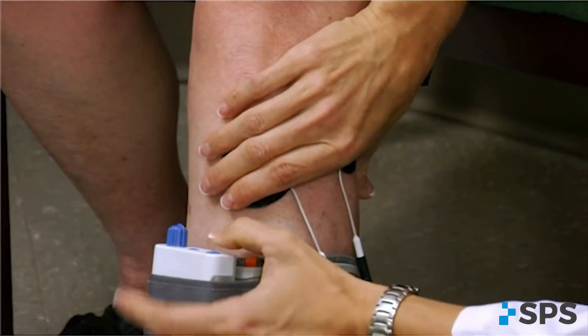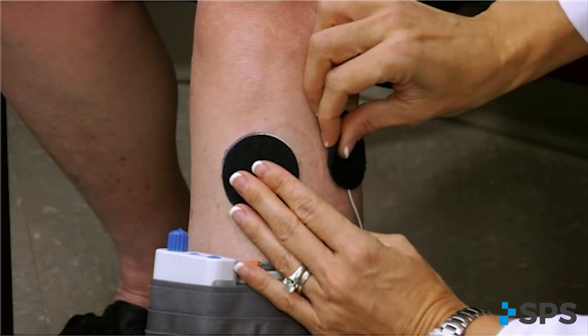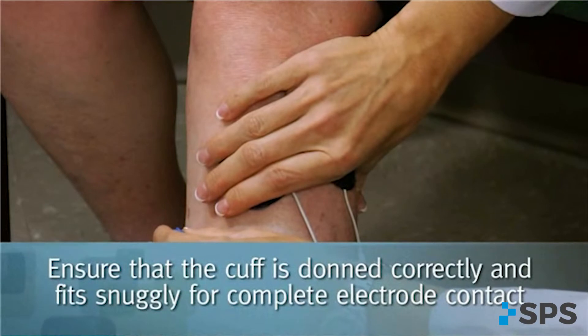You may need to increase the intensity to elicit a functional foot lift if the foot is not lifting enough or not lifting in the right direction. Assess the cuff and electrode alignment and ensure that the cuff is donned correctly and fits snugly for complete electrode contact with the skin.